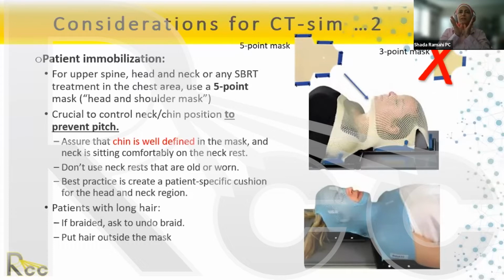We noticed recently that our CT Sim therapists have loose masks. So you have quite a 2 to 3 degree pitch on the neck. So we did a root cause analysis, and we found two things.